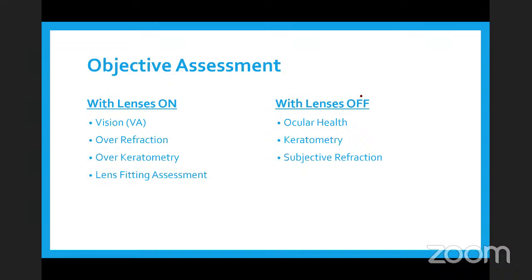So probably you don't start with a 6/6. You already know the patient's best corrected vision on delivery, when you delivered the lens to the patient, was about 6/9 or 6/6. Just start with one or two lines above the best VA, what you already know. That's where the practitioner's preparation comes into place, so you know the patient's background.